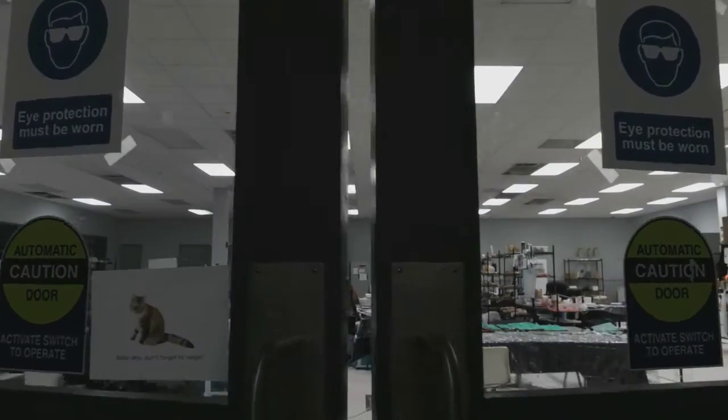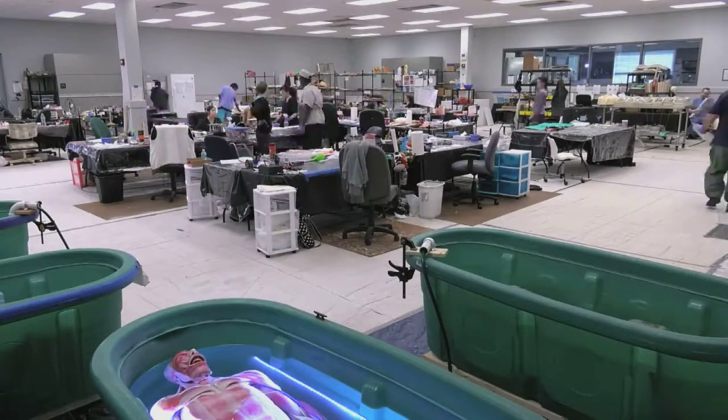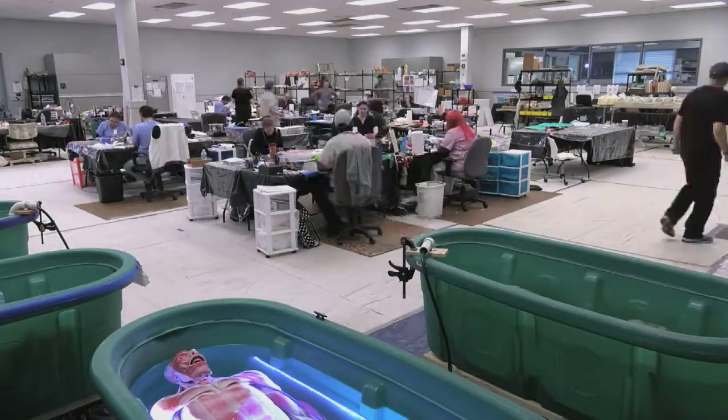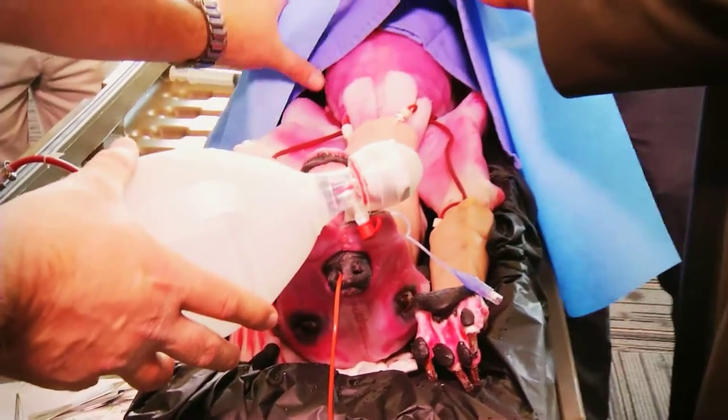We recreate every major tissue and organ system in the human body, and it takes about a thousand hours to create each synthetic human. Although Sendaver started with the creation of synthetic human tissues, we're now expanding into veterinary medicine.